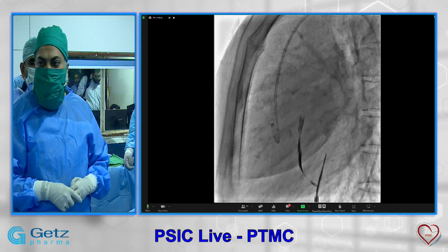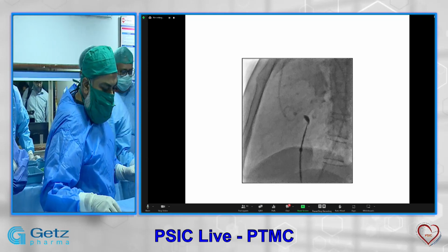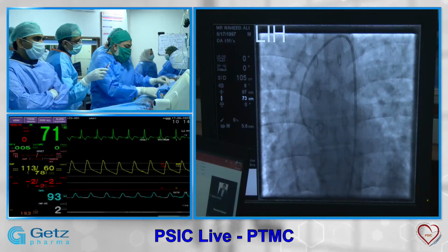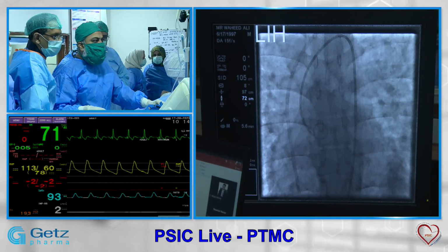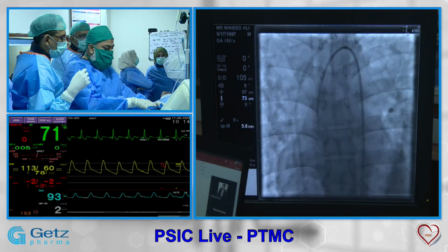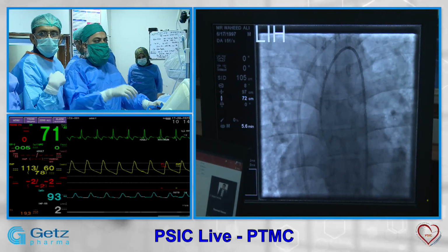Next, I think we just go for the live case now. In this one, they have already done most of my job. In this one, can you show us this?